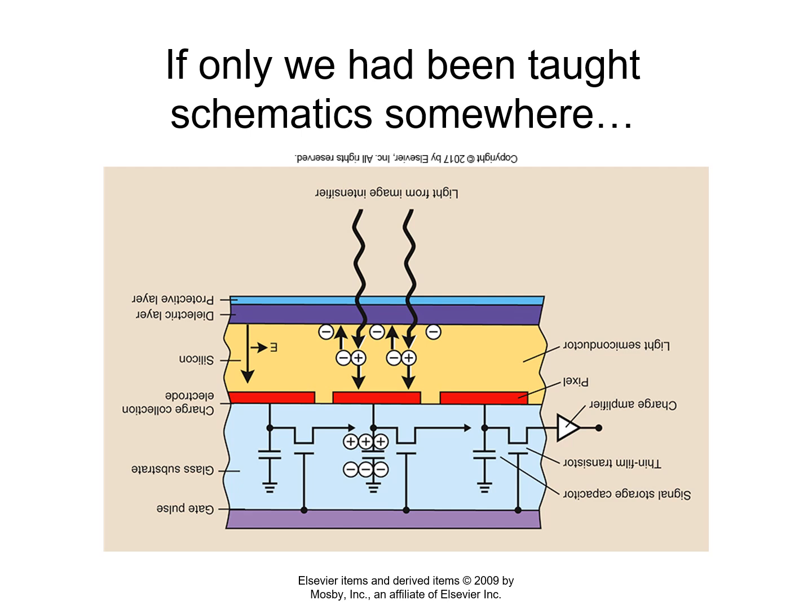And that's where those charge electrode pixels come in. The charge electrodes are tethered to capacitors, and that capacitor is tethered to the ground, okay? So effectively, the positive ions pick up loose electrons from the charge electrodes, and then the charge electrodes become positively charged. And then those positive charges start stacking on the capacitor plate that they're tethered to.